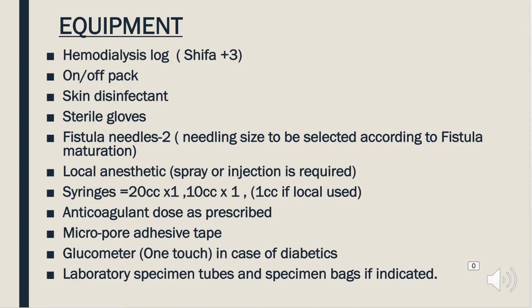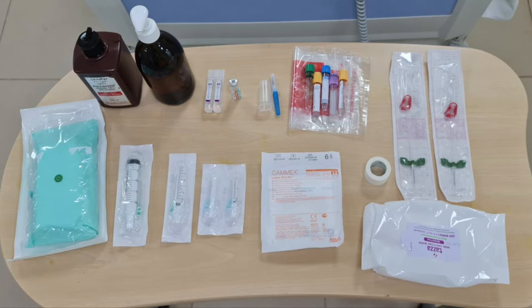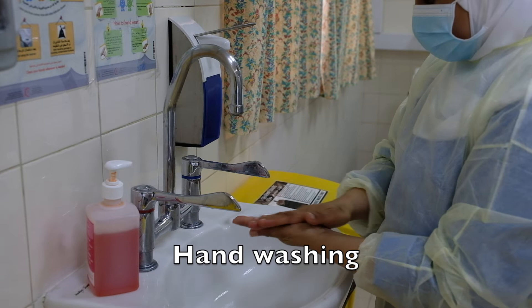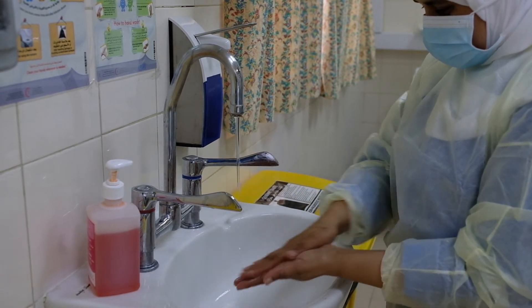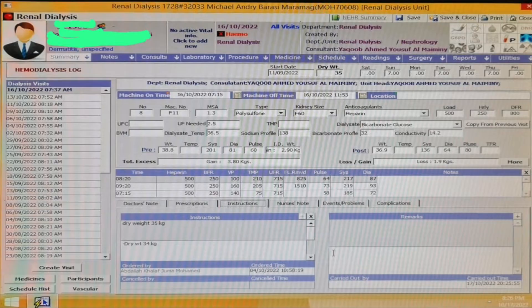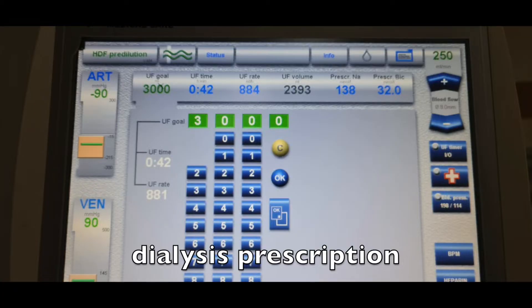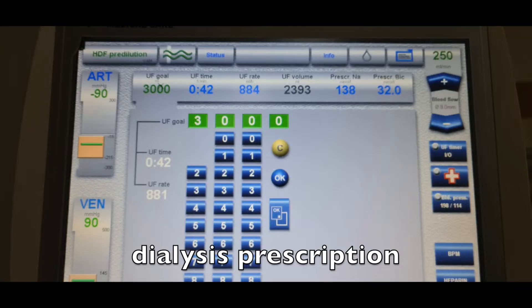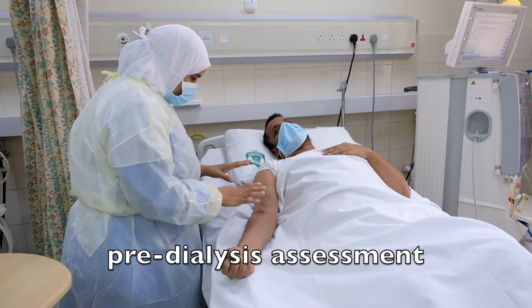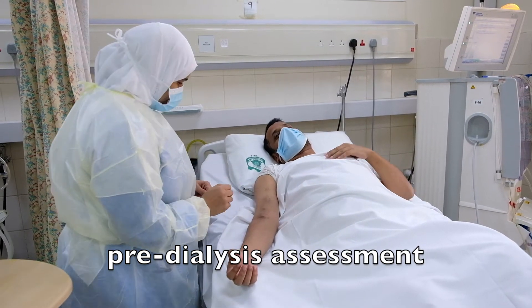Equipment is as follows. First, perform hand rubbing or hand washing as per policy and procedure. Check the pre-dialysis instructions and ensure that the machine is set up as per the dialysis prescription following pre-dialysis assessment. Ensure privacy if applicable. Explain the procedure to the patient and give instructions.